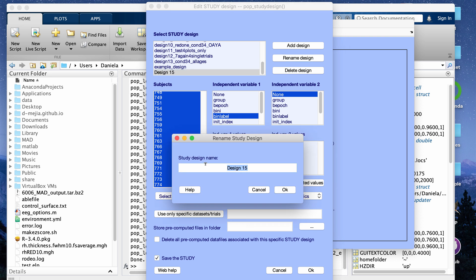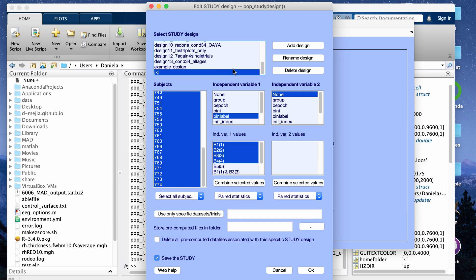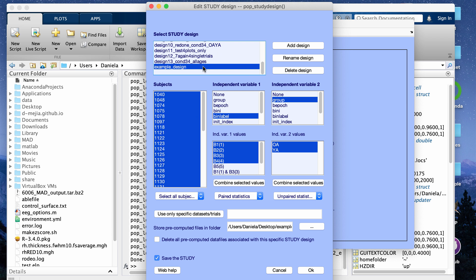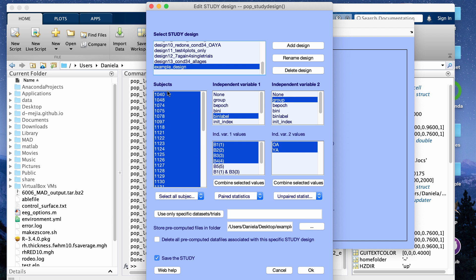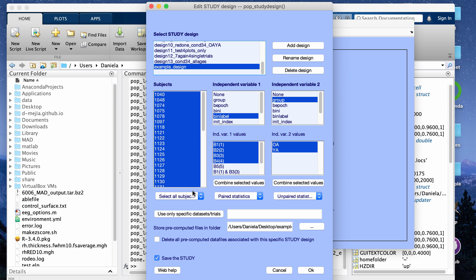If you want to name a design, you can click 'Rename Study Design', type in whatever name you want, and click OK. I'm going to delete that design because I already have an example design created. Clicking it loads in the variables I want to use for this particular design. Depending on what type of analysis you want to run, that will affect what type of design you use. In my case, I want to load in all 42 subjects, which are all highlighted in the subjects box. The variables I want to analyze go in Independent Variable 1 and 2.